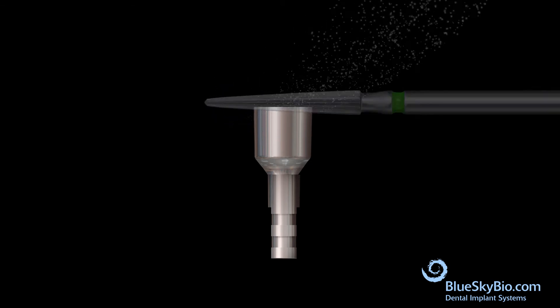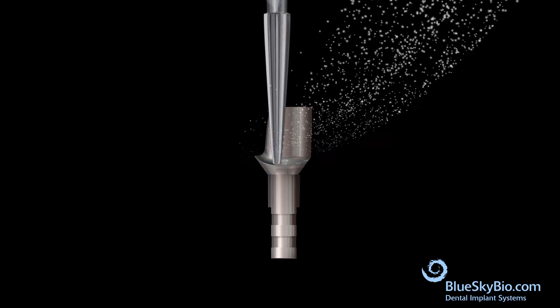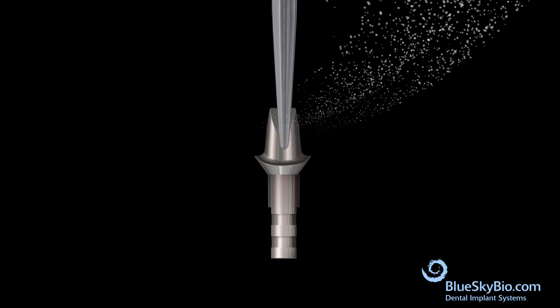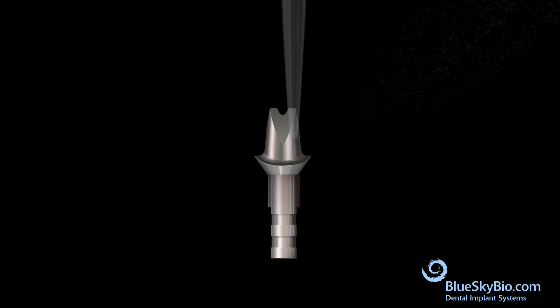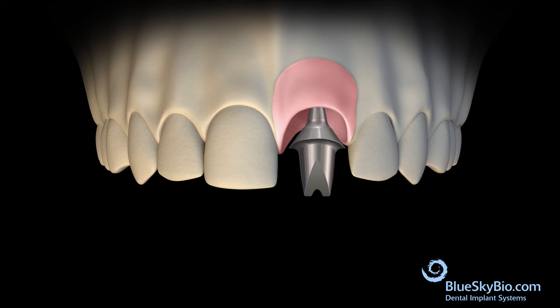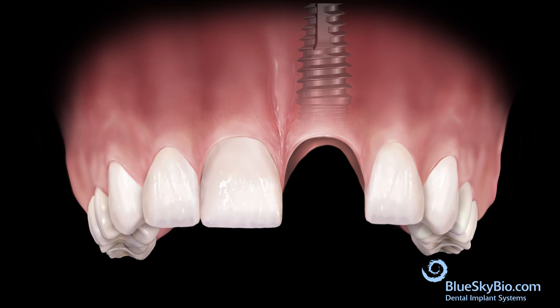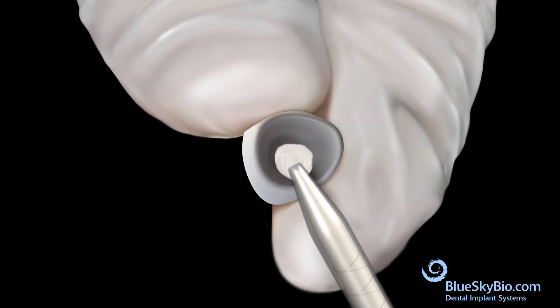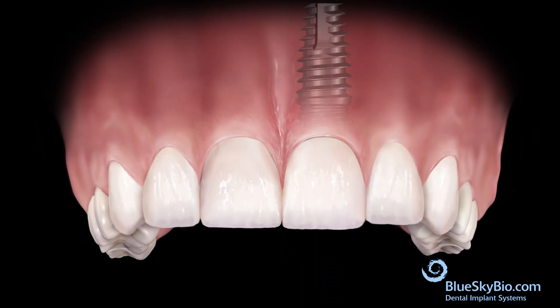Use a carbide bur to shape the multi-purpose abutment. Place the abutment into the stone model to verify the fit, then place the custom abutment in the mouth. Apply bonding material to the crown, bond the crown to the abutment, and remove excess bonding material.